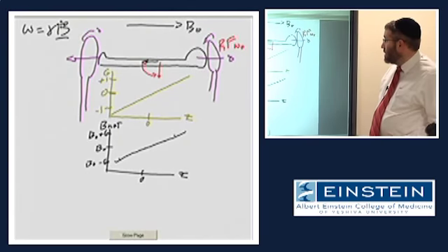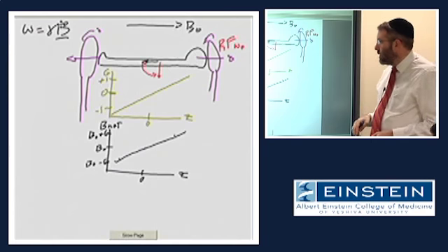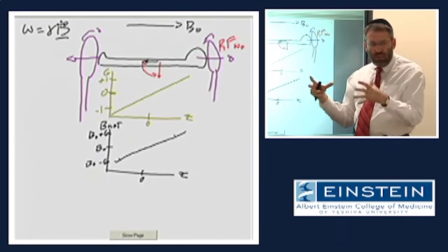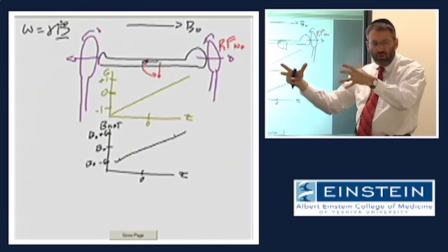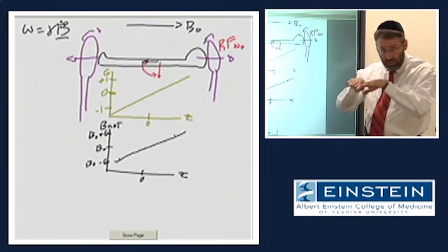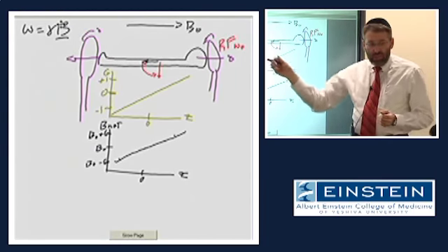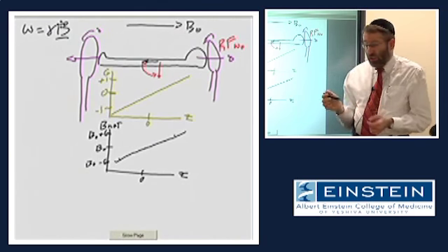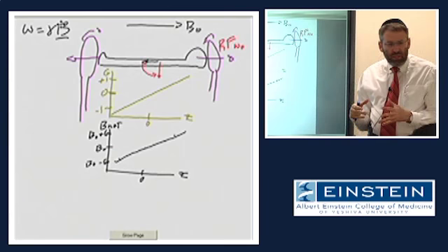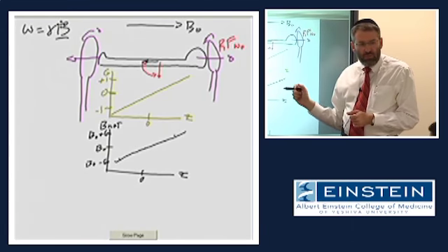This is regardless of whether you're just scanning the head or just the abdomen. These are built into the main piece of hardware that's sitting there in your room. If you go inside the bore of the magnet and start to peel away the layers on the inside, this is one of the things that's built into the inside of the bore. These coils have nothing to do with the receiver coils that we use for detecting the signal. These are specifically to generate these gradient magnetic fields.